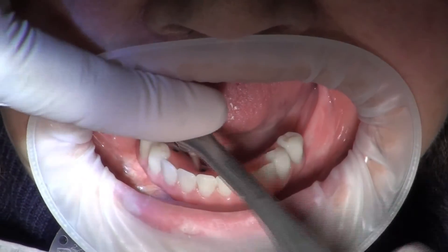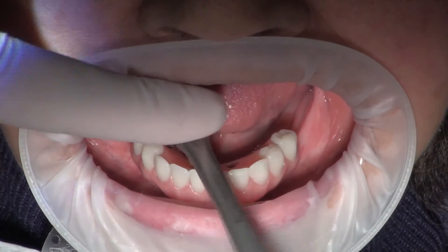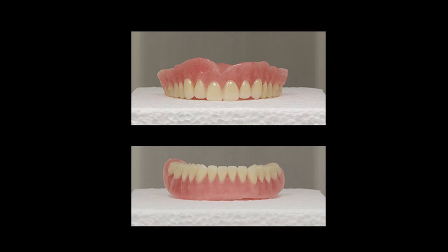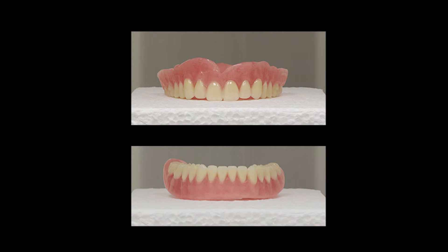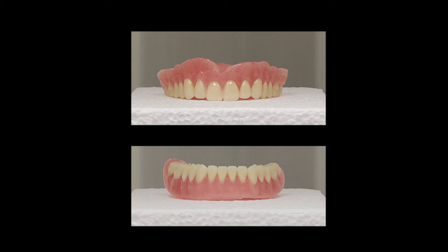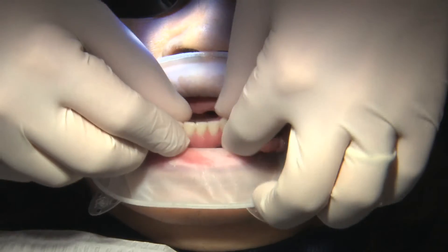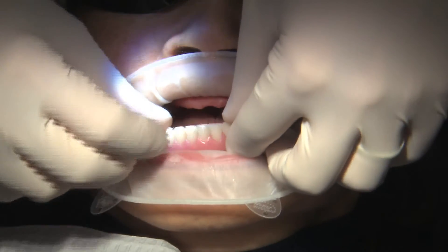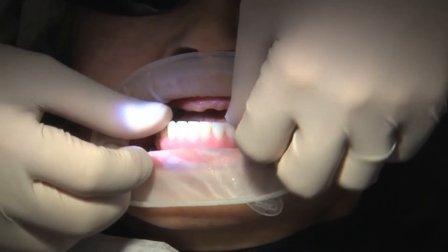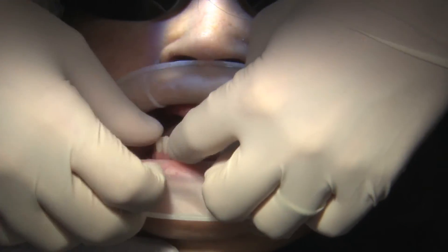The diagnosis, treatment planning, surgery, provisional denture, and final restorative steps of the treatment plan all leverage digital dentistry. The convergence of these technologies is enabling simpler, more convenient, and more affordable restorative protocols.